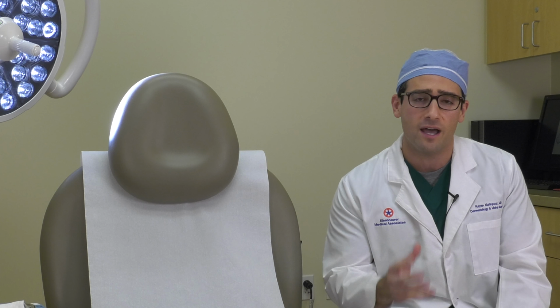In 2018, melanoma affected 150,000 people in the United States. The number one factor in their treatment is the stage at which it was diagnosed. The pieces of equipment that we're going to talk about today can allow us to find melanoma at the earliest stage possible and allow simple excision as the treatment, without needing any chemo or any further radiation.